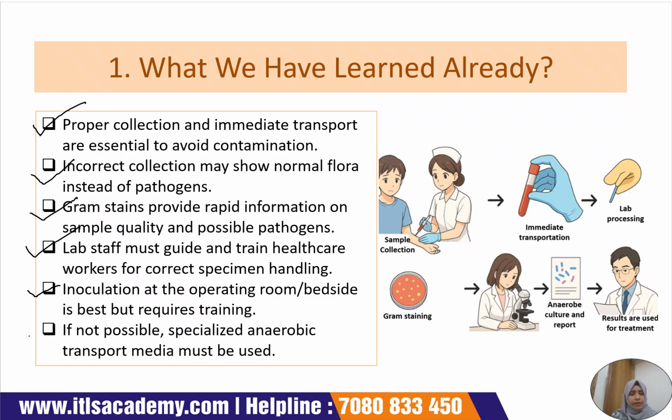Sixth point, what we have learned is if bedside inoculation is not feasible, if it's not possible, then specialized anaerobic transport media that is provided by the lab should be used to preserve the organisms until they reach the laboratory.